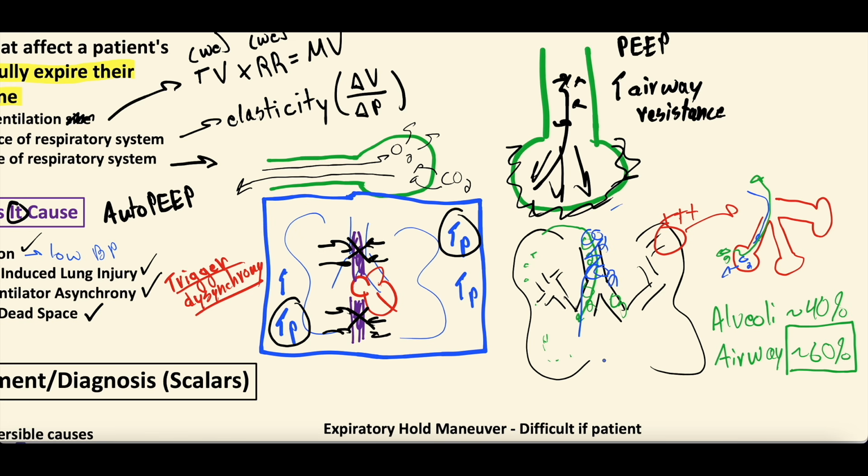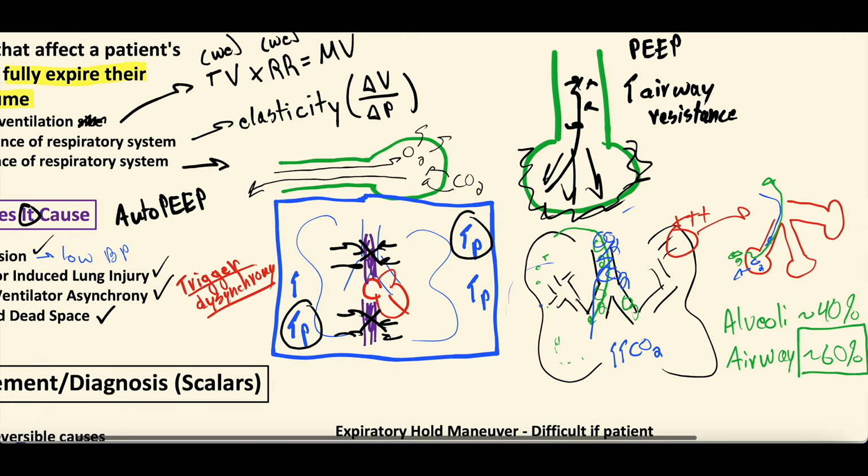And increased dead space can lead to increased carbon dioxide levels because you're not able to breathe off that carbon dioxide, since there's so much dead space. And when you AutoPEEP, when you breath stack, that increased pressure can cause increased dead space because you're not breathing out all that volume, right? And each breath you might start to breathe out less and less volume.